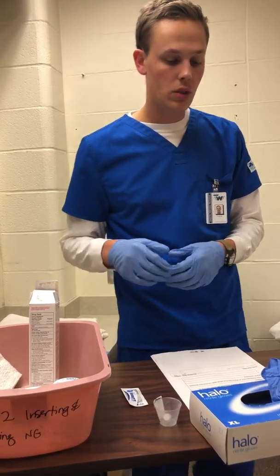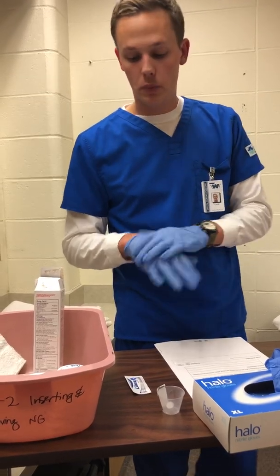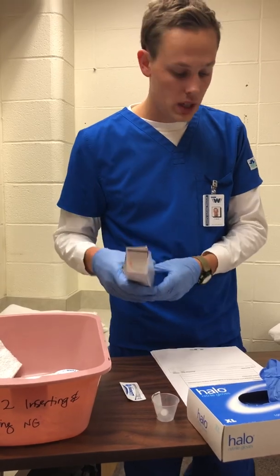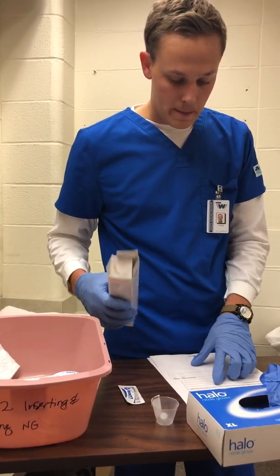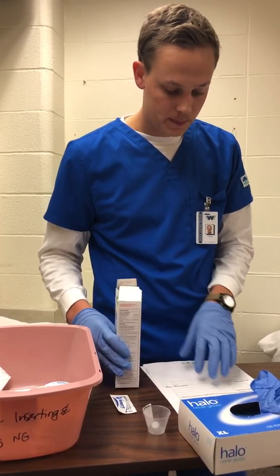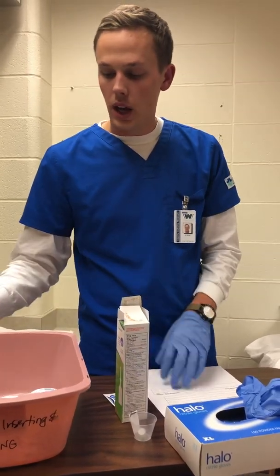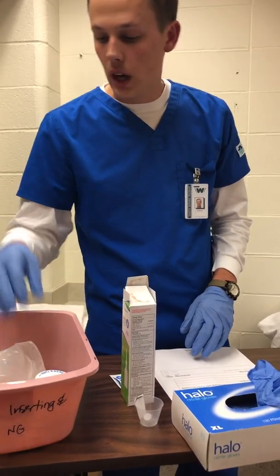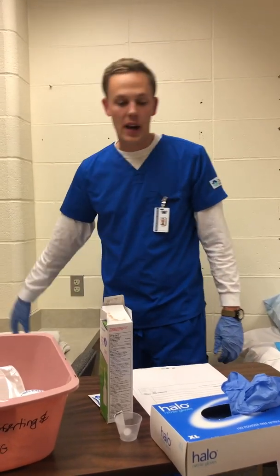So again, we're just gonna do a quick med check. So I'm gonna perform hand hygiene in the med room. I'm gonna put on new gloves, and I'm just gonna make sure I got the same thing here. So I have a call for a 4.5 fluid ounce enema as needed, and here is what I got, a 4.5 fluid ounce enema. And again, I'm gonna have to take in a thing of lube. I'll take in a washcloth again with me, and I will also be taking a bedpan, a chuck, and a bath blanket in.